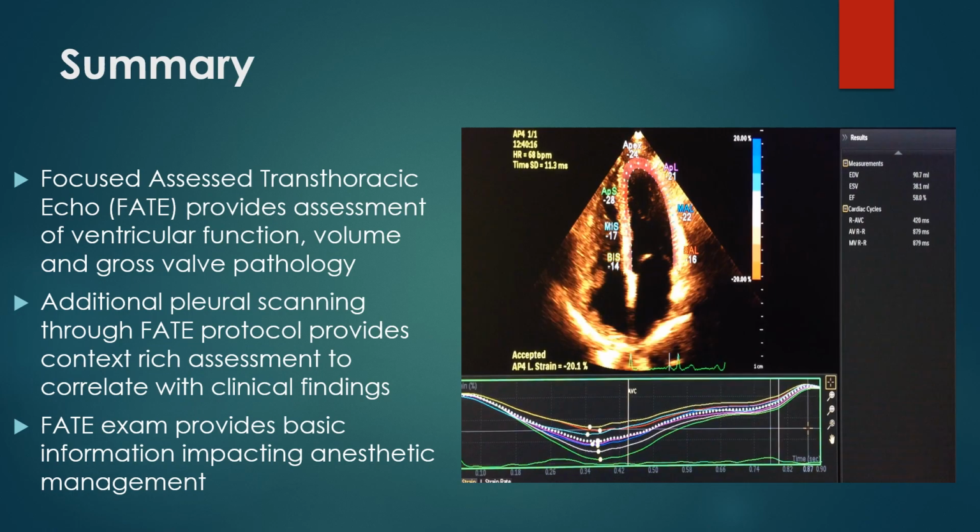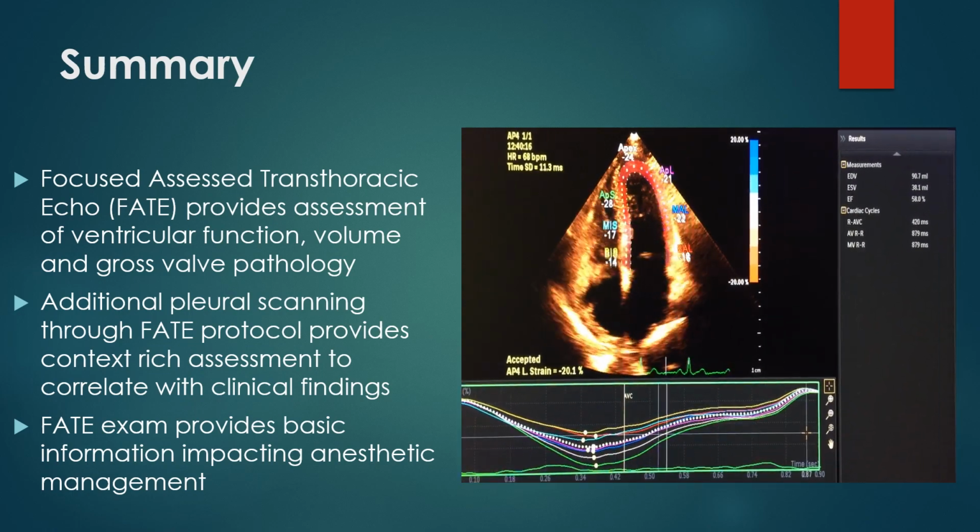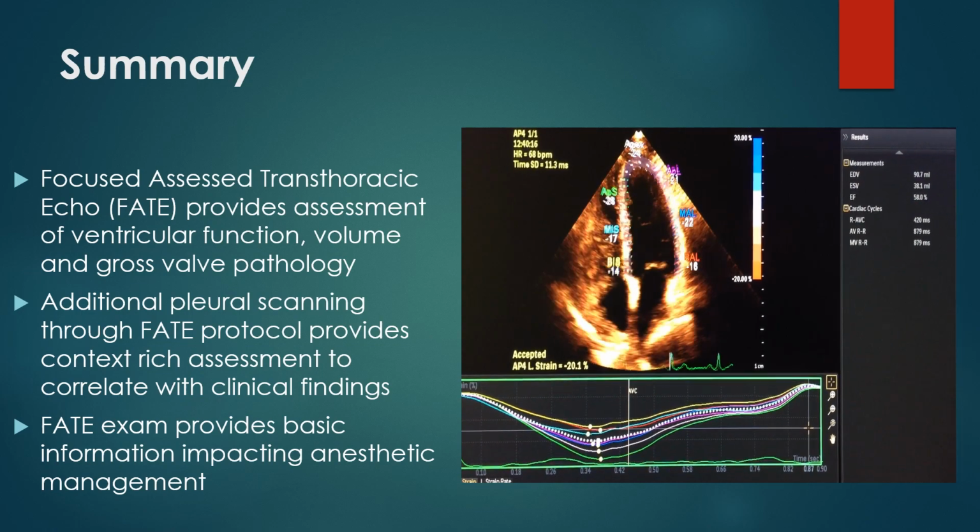And the FATE exam provides some basic information in perioperative anesthetic management. The more you use it, the more comfortable you are with your assessment.